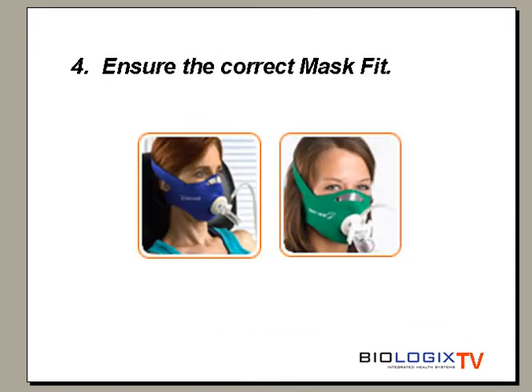Any leak in the mask could invalidate our RMR number, so make sure the pneumotach, seal, and the fit of the mask are free of leaks. Make sure you have the right size mask for your client.